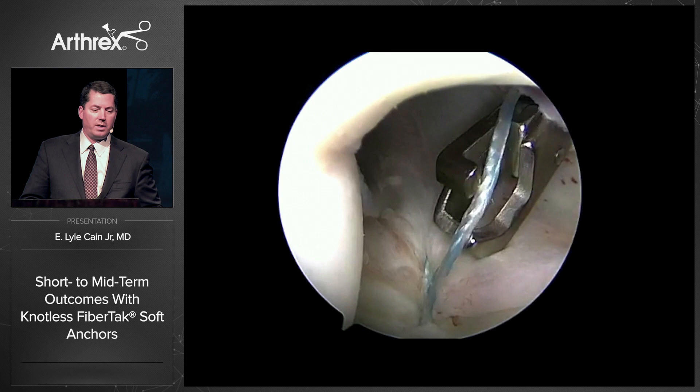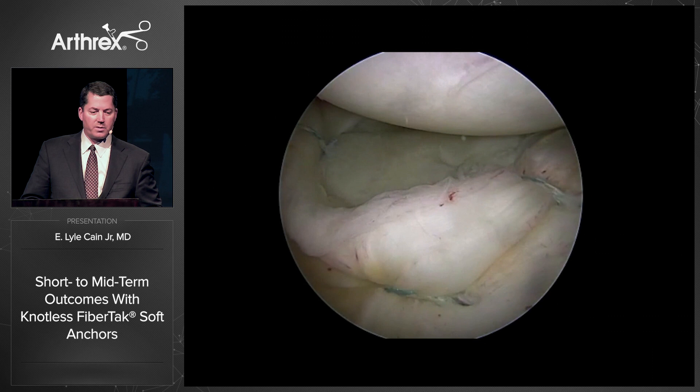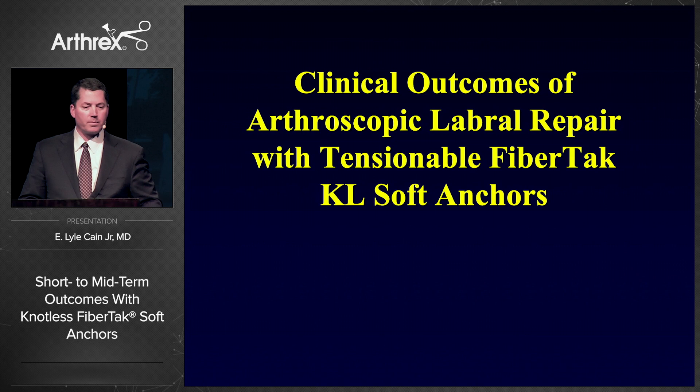You'll see how I pull it three or four times and can really tension it very tight. When you look at the final picture from the posterior portal, you see a simple stitch on the right and a mattress on the left — making a nice big labral bumper on this NFL football player's posterior labral repair.